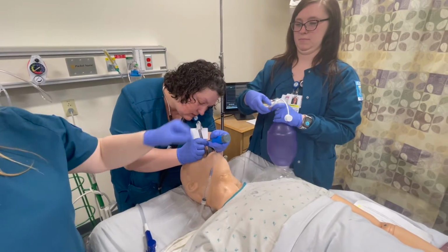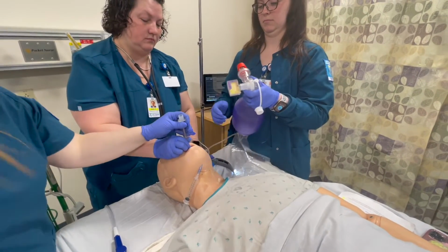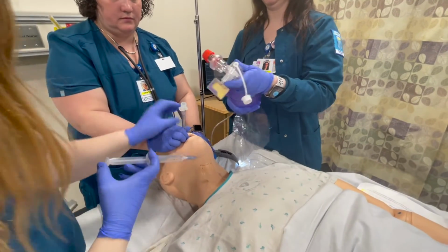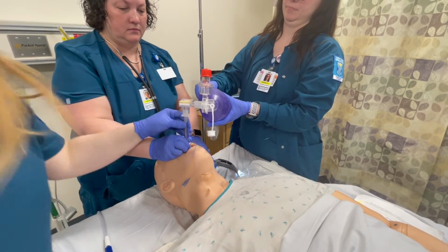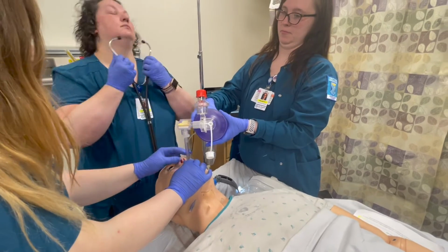So Kenzie is hooking up the capnograph or capnometry. 24 at the teeth. I'll go ahead and inflate the cuff. Do we have color change? Yep. I will go ahead and hold the tube while you listen for lung sounds.